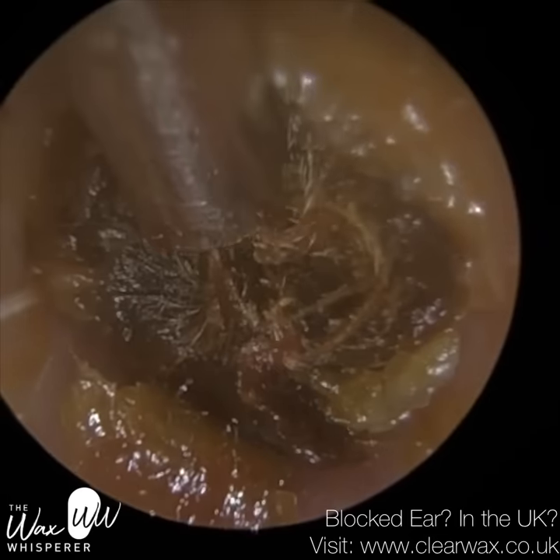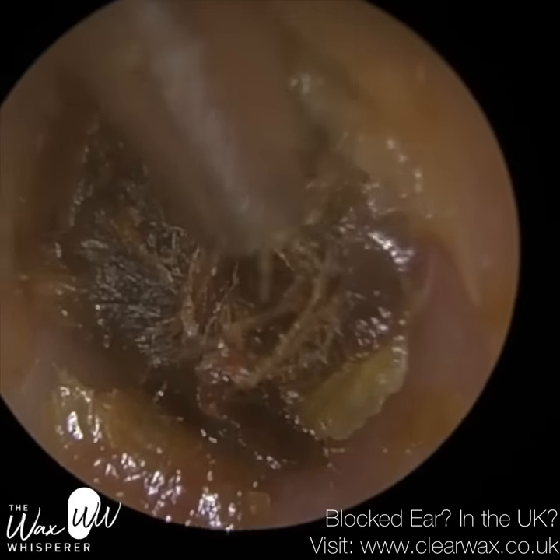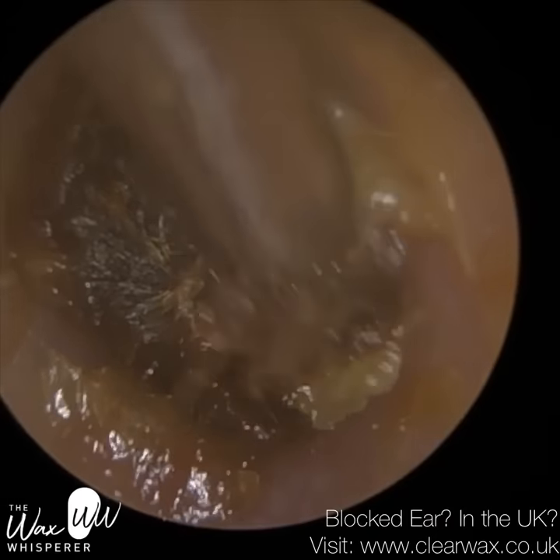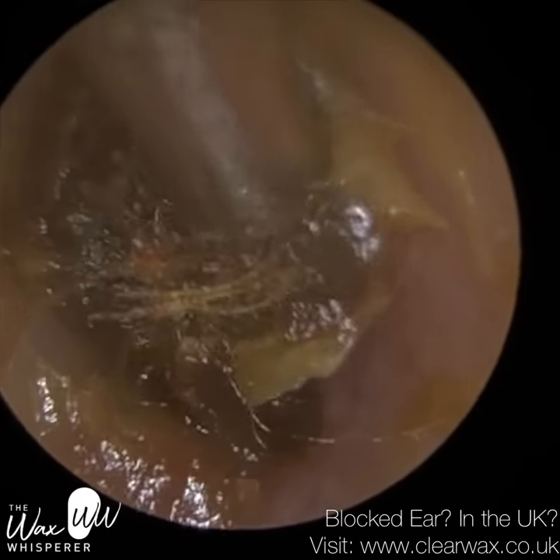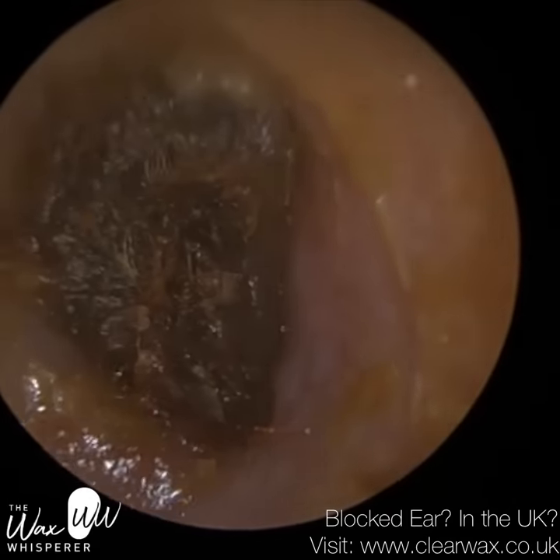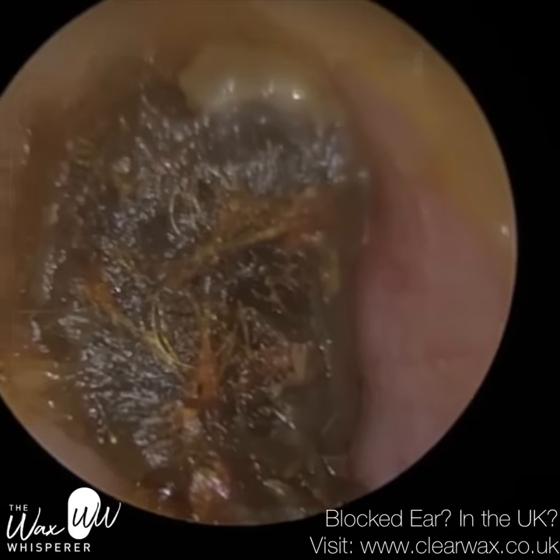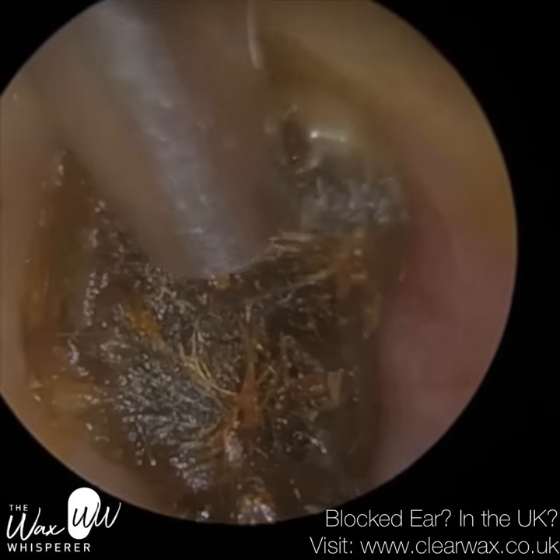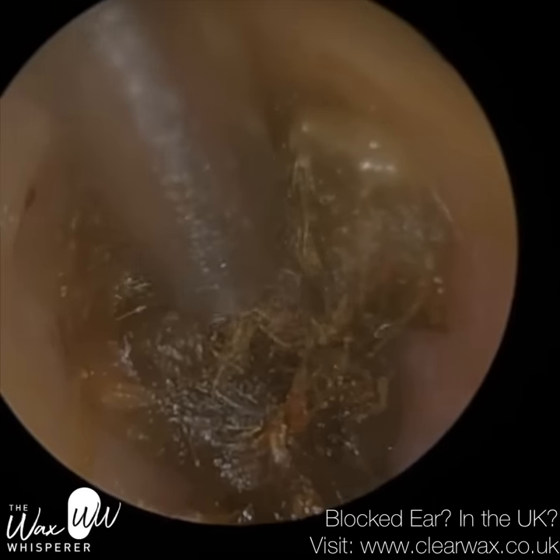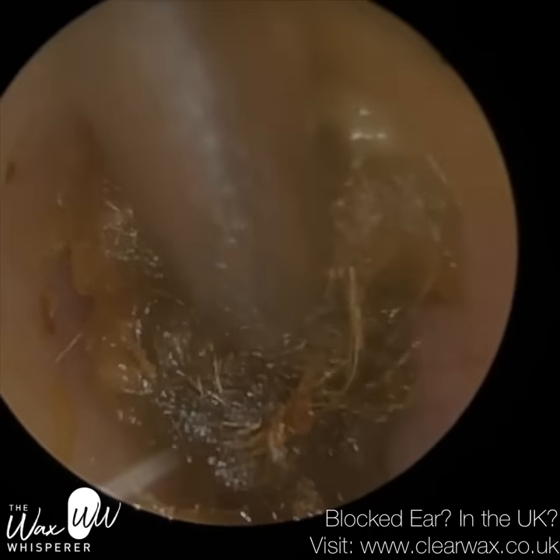With an endoscope, there is a 3D endoscope, so you view it on a monitor and you wear 3D glasses, but essentially what we're doing here is viewing it on the screen of, I'm using the iPhone SE actually, the 2022 version, the third generation. Because you're viewing it off a flat screen, you're not able to use binocular vision. So if I had one eye closed, I'm going to get the same view compared to having both eyes open. But with an ENT microscope, if you just view with one eye, you're not going to get that depth perception.